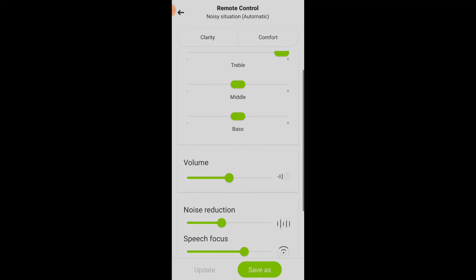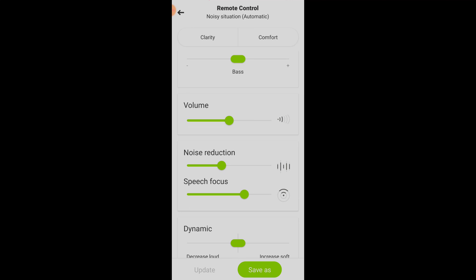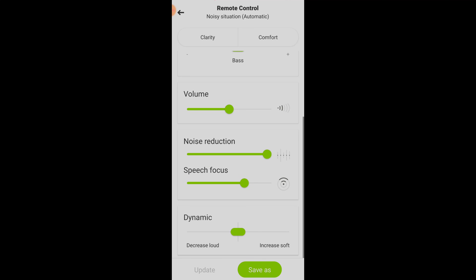After you determine whether or not increasing treble helps, I would recommend adjusting noise reduction. This feature takes the steady-state noise inside of the restaurant and reduces the amount of amplification given to that noise. After you determine if that feature helps, I would move on to Speech Focus, which controls the direction you want to pick up sound from. In a restaurant, if you do not want to hear the people behind you, you can narrow the pickup range to directly in front of you — just keep in mind, at the strongest setting, you need to make sure you are facing the person you want to hear.